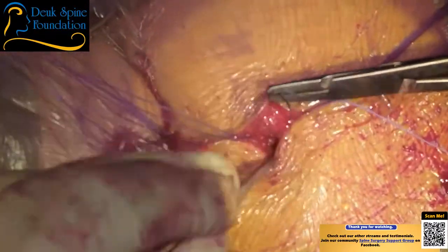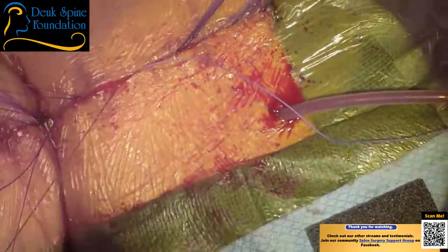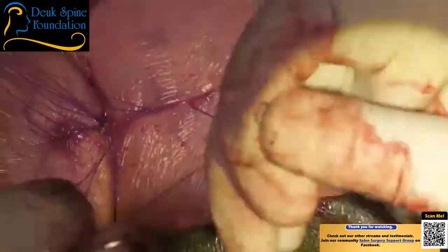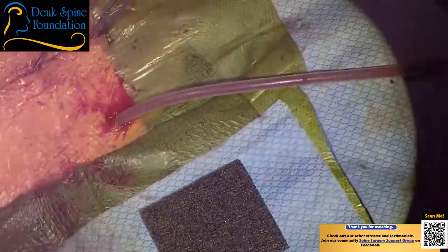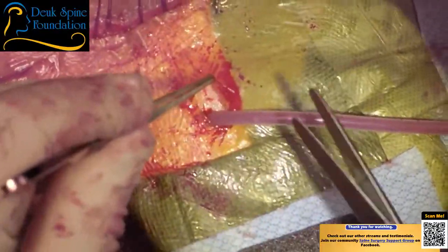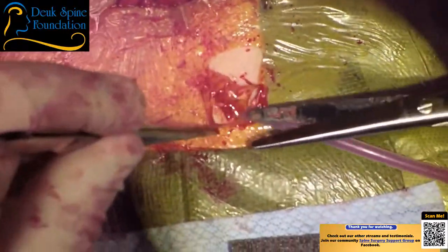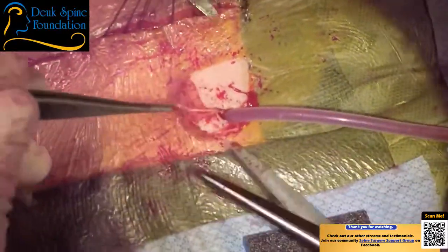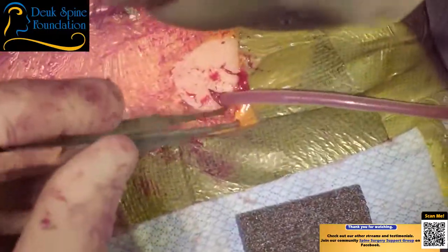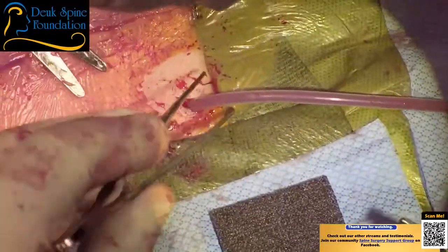I'll have her done here in five minutes, and a bandage on in 10. Okay? I need a drain stitch. You want to do those? He needs scissor. Give him scissor. Scissor for him. Thank you, Dr. Atwater. We don't normally use the IV, but... Stitch. Ready? Watch that scissor, don't let it fall.